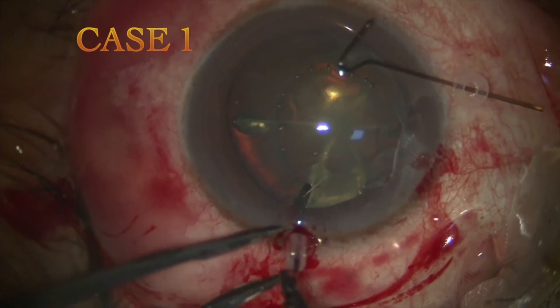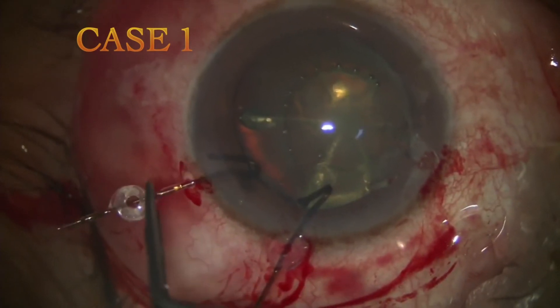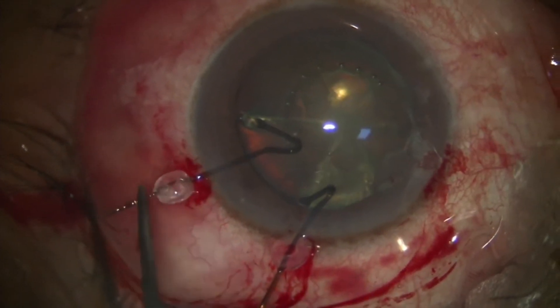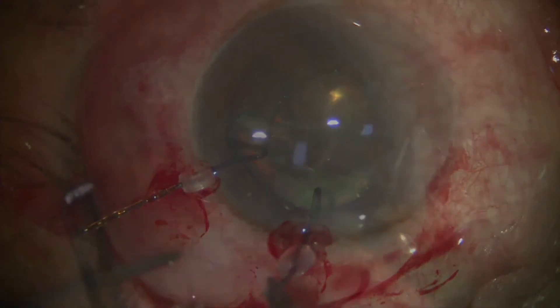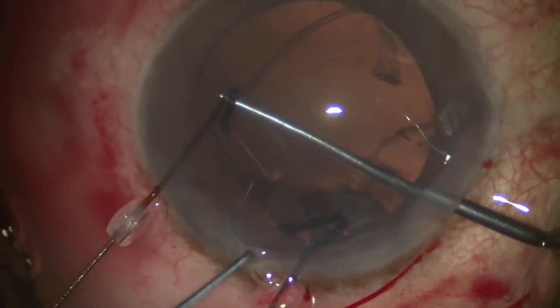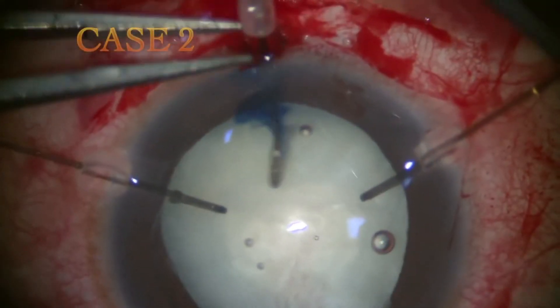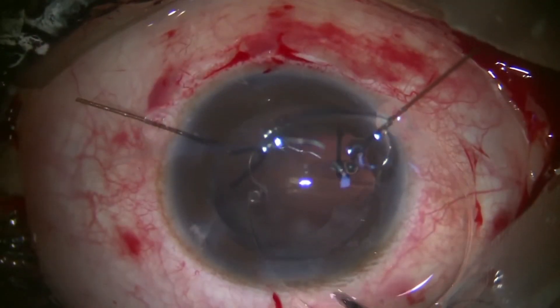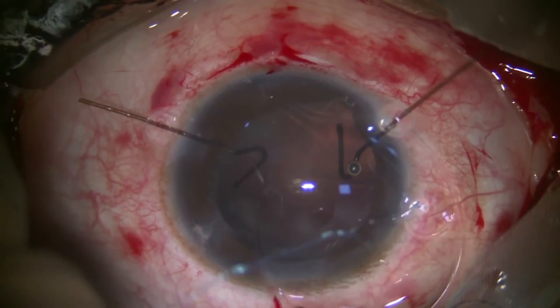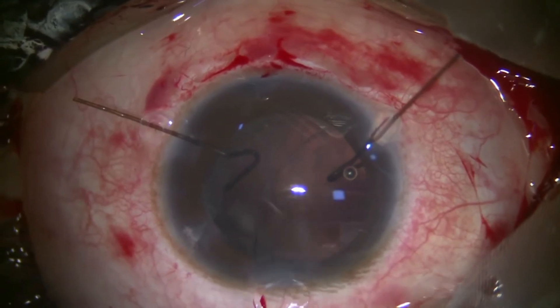In cases of panzonular weakness where there is subluxation present, one can perform a femto-assisted rexis with fragmentation of the lens. Capsular hooks will support the subluxated area till phacoemulsification of the lens, followed by safe phacoemulsification in the bag and placement of the endocapsular ring. In cases where subluxation is more than 6 clock hours after phacoemulsification, a Cionni ring can be used to secure the capsular bag to the sclera, followed by IOL implantation in the bag.